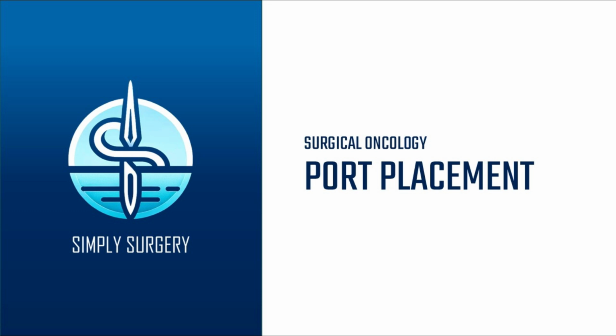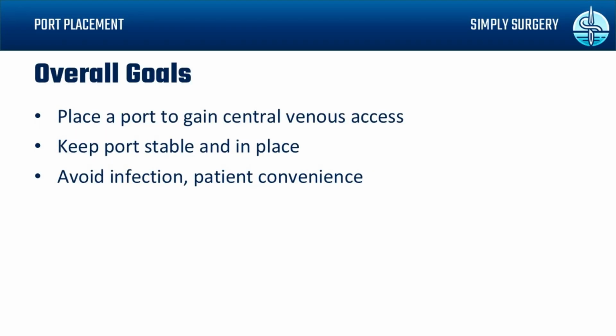Today we'll be discussing central venous port placement. Thank you, Nico. So first thing we want to dive into is what is the overall goal of this surgery? The overall goal for this operation is to place a port for central venous access and to keep it stable and in place under the skin. And the reason that we do this is for long-term administration of medications or fluids.